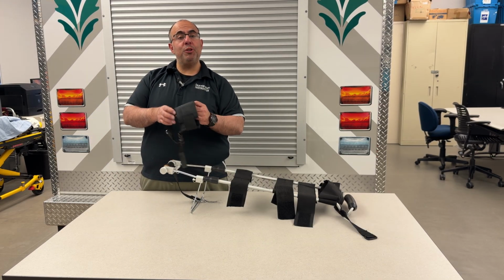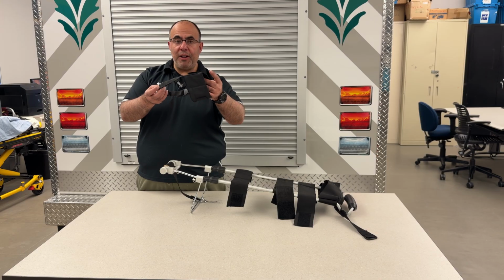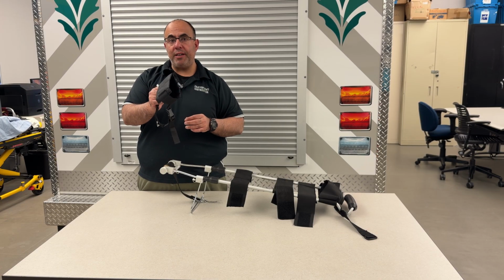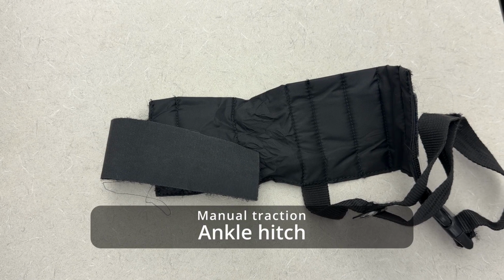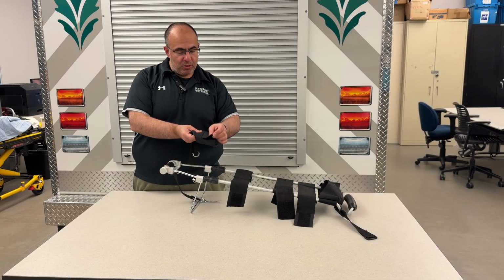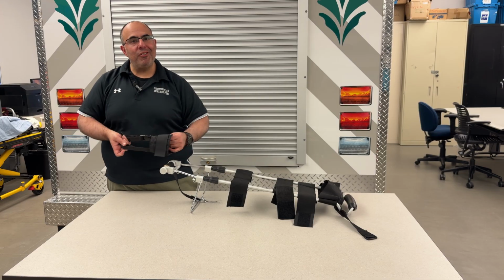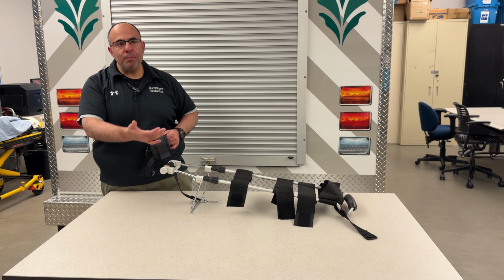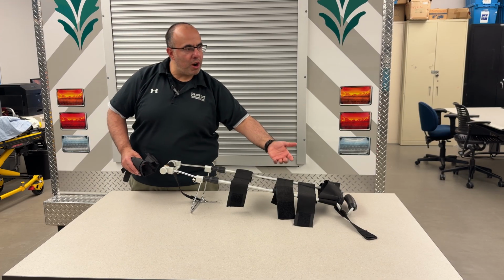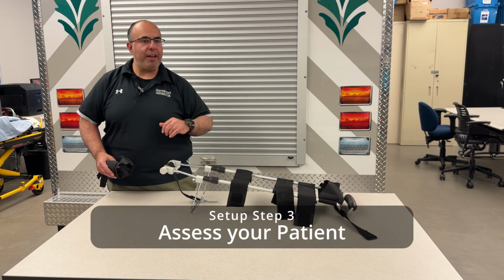As they're applying manual traction, this, in my professional opinion, is the best device to put onto that ankle as you're applying manual traction. This is the ankle hitch. As you wrap it around your patient's ankle, this gives you that extra leverage as you're applying that manual traction for your patient.